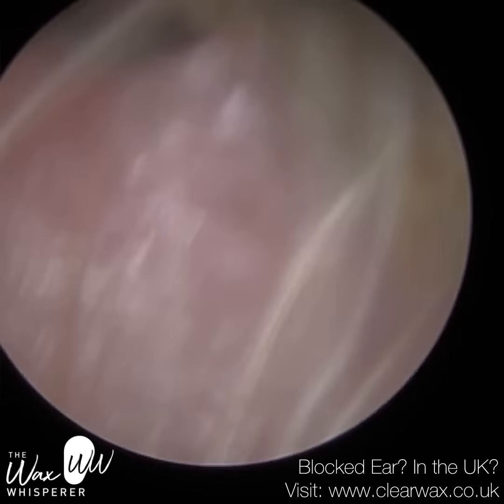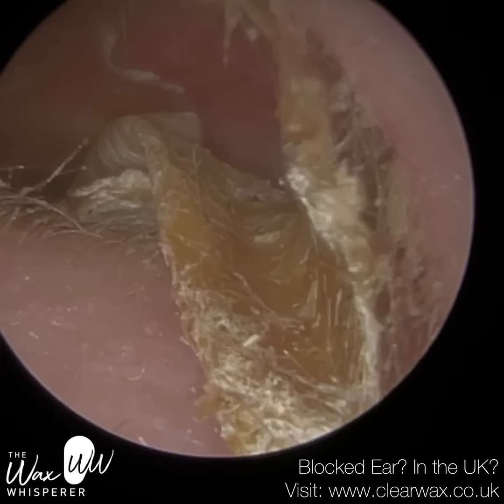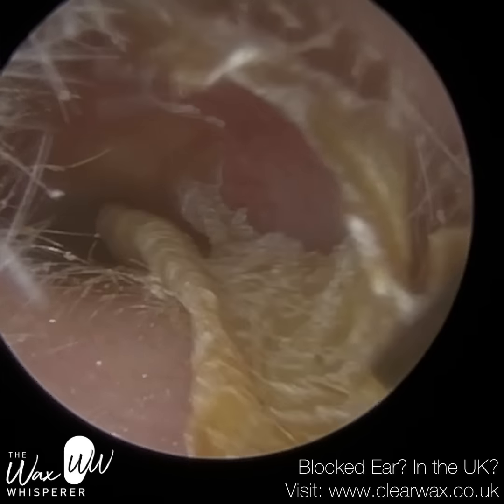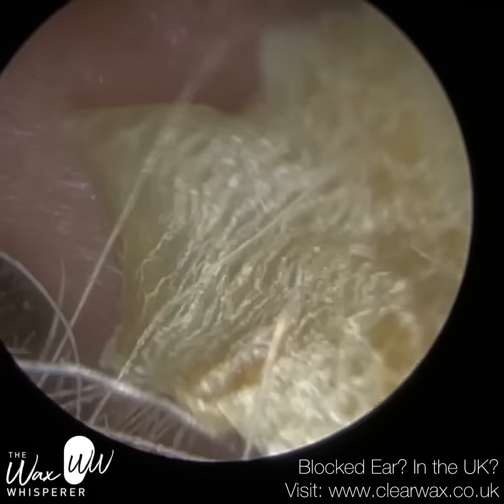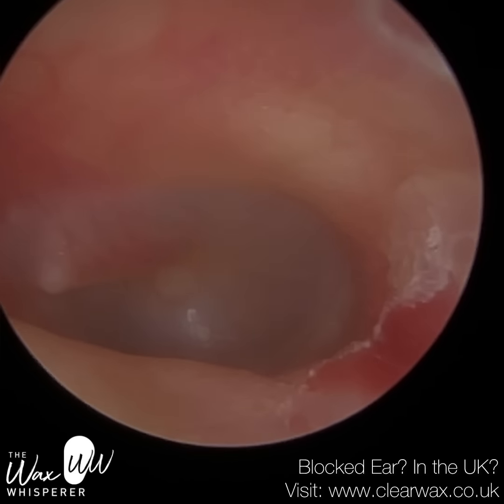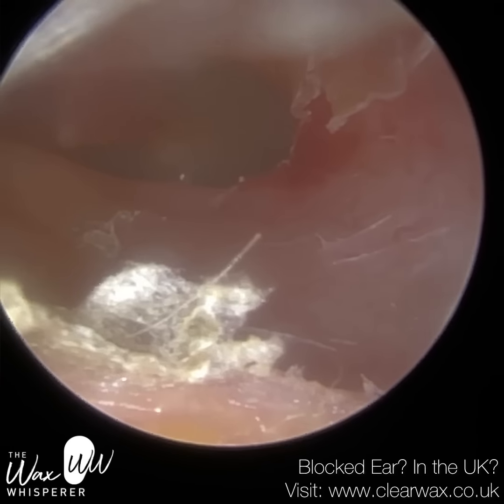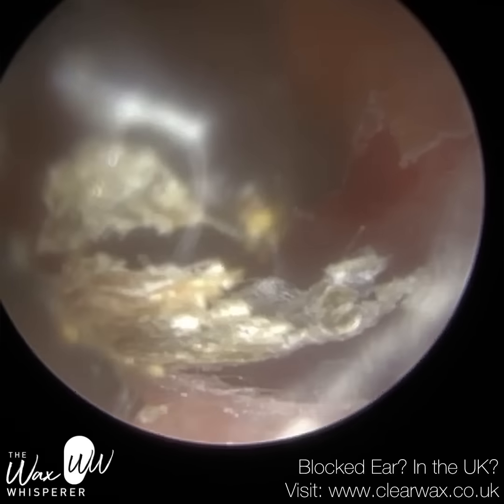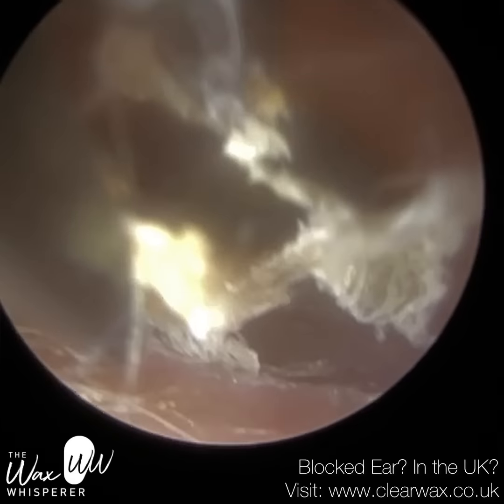So pull that away. You've got this thick layer of keratin that we're going to extract using forceps. There was some blistering actually as a result, so it should settle fine, but the patient didn't notice. I showed it to them, but again, the skin was so strongly adhered that it did cause a bit of blistering just there at the base of the ear canal. It's like sometimes when you've got some dead skin on the side of your thumb or fingertips and you peel that away. There's just some keratin at the front, lateral process part.